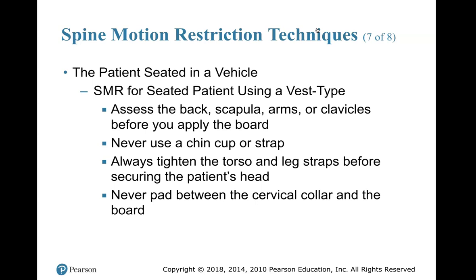A seated patient using a vest-type device would be a KED device in this situation. Assess the back, scapula, arms, or clavicles before you apply the board. Never use a chin cup or strap. Always tighten the torso and leg straps before securing the patient's head. Never pad between the cervical collar and the board.